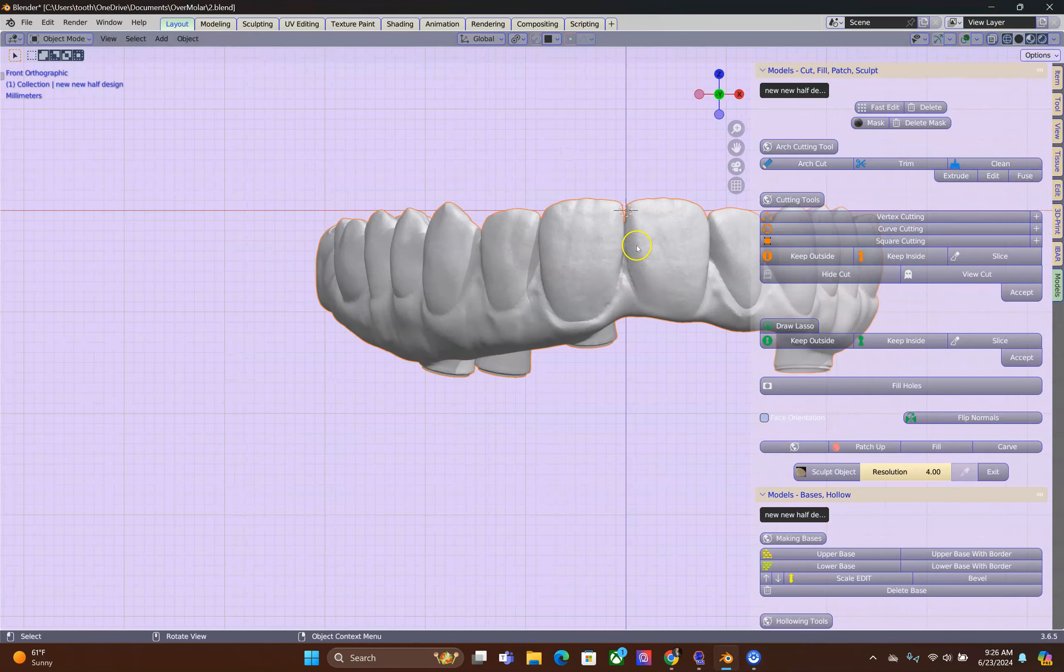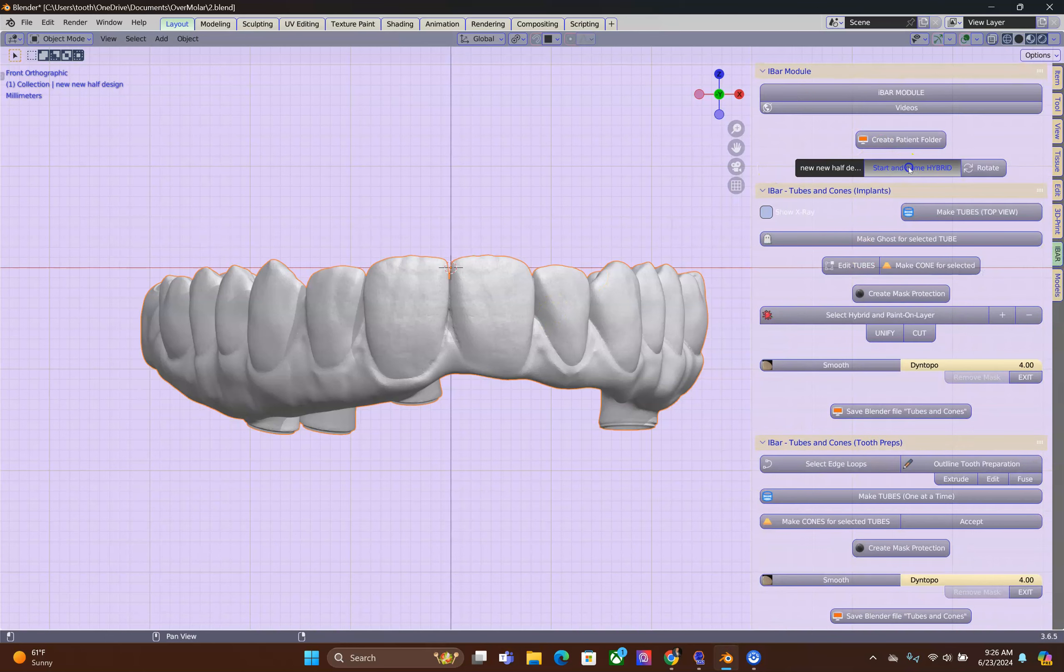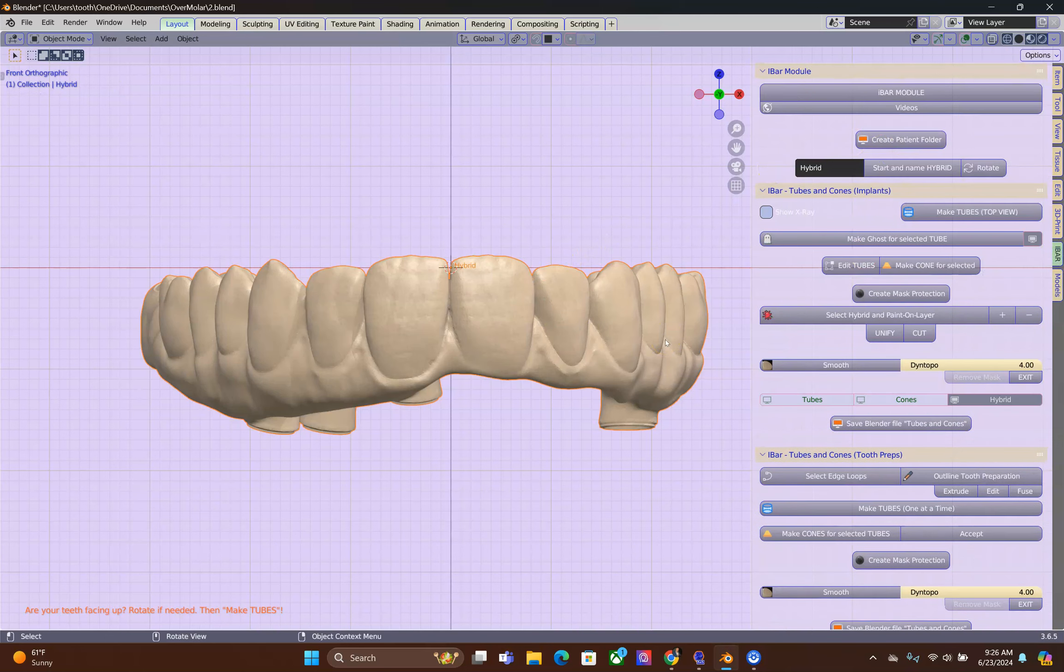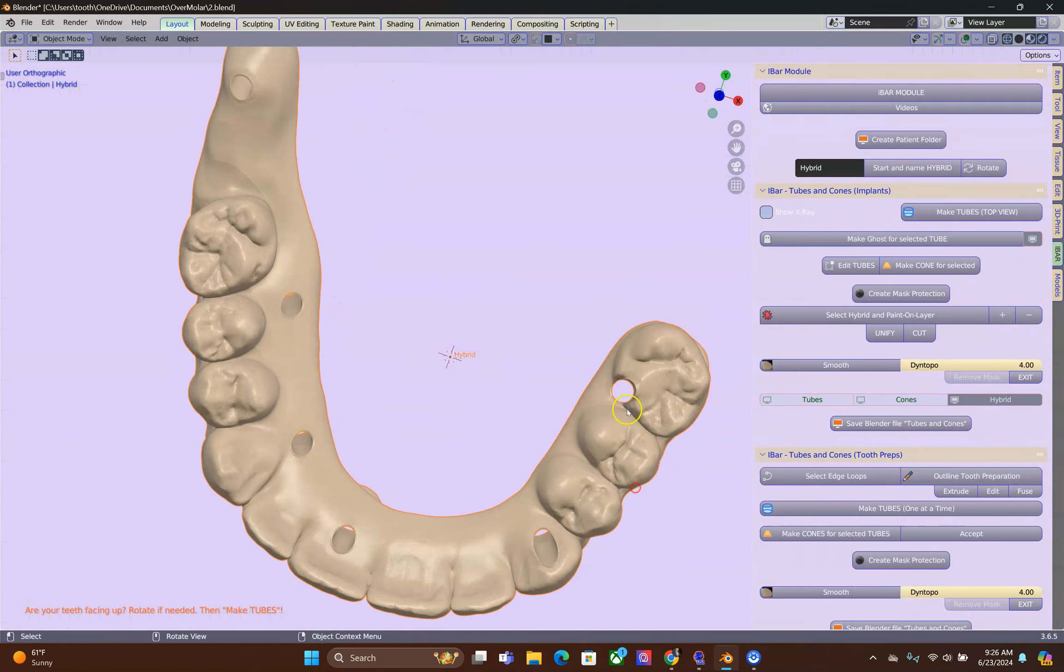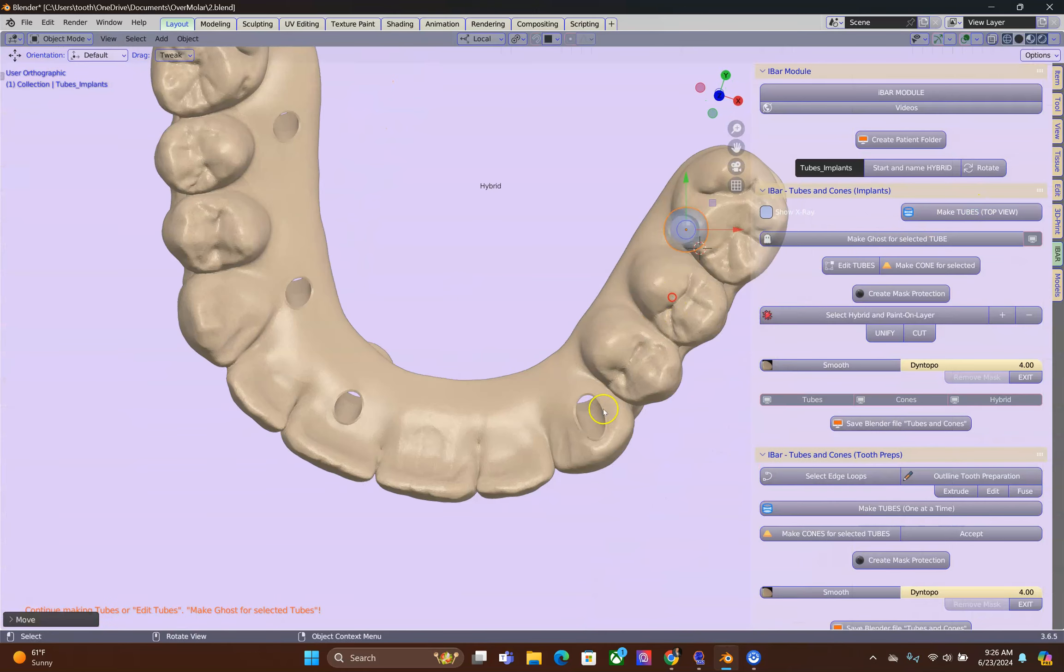Alright, now check that the incisals are standing upwards, start and name your hybrid. And then following that we will plot the tubes.